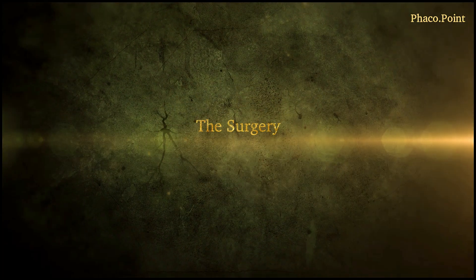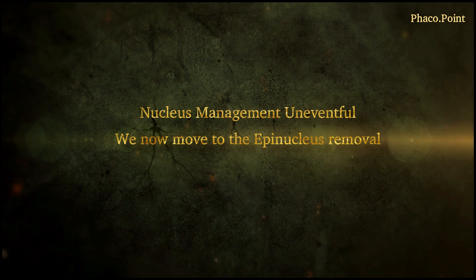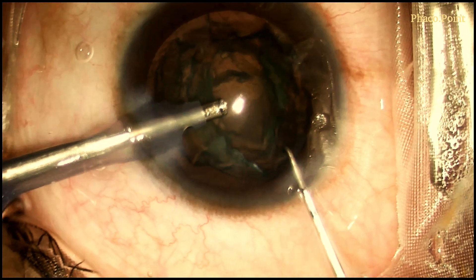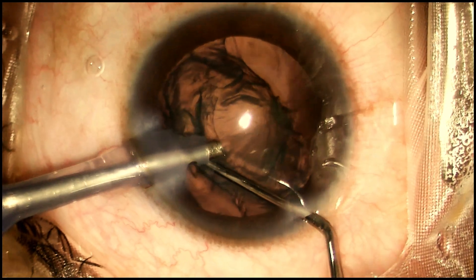Let's now move to watching the surgery. The nucleus management was uneventful. We start the surgery from the epinucleus removal. Following the completion of the nucleus management, it is clearly evident that there is no sign of any PCR. The chopper is replaced with a dialer and we proceed to the epinucleus removal with the epinucleus mode of phaco.